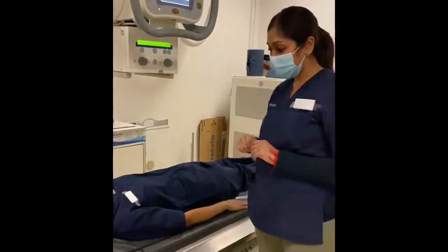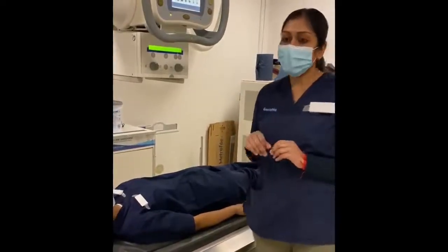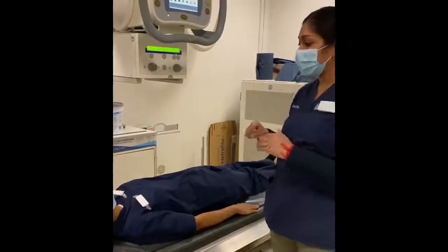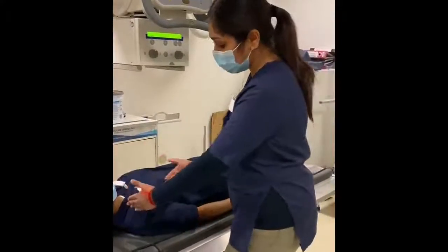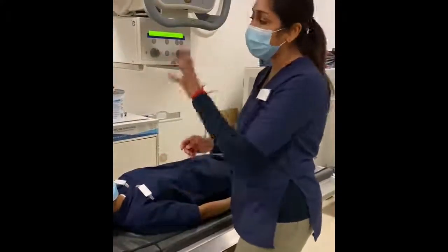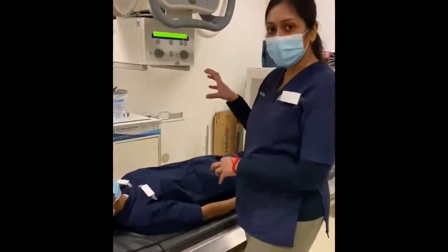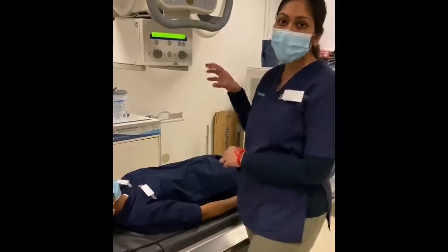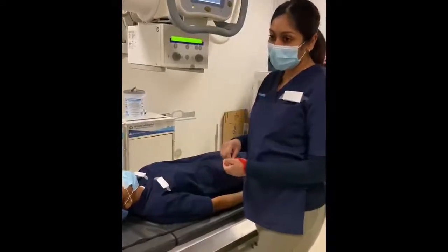Our patient is going to lie supine. Just take note of your anode heel effect. Remember that the thinner area of the T-spine, which is the upper portion, should be on the anode side, and the thicker portion should be on the cathode side, because the intensity of the beam at the cathode side is higher.